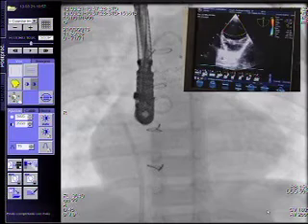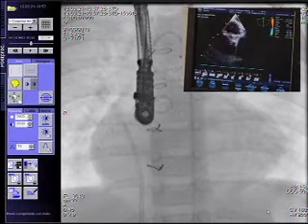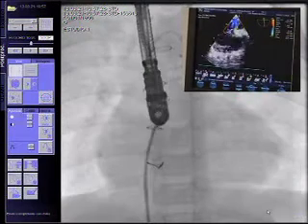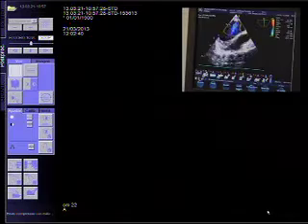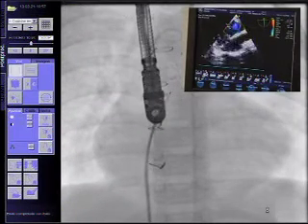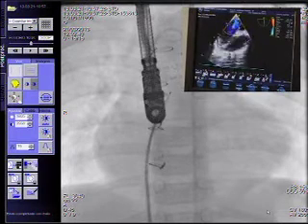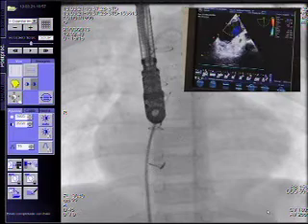Enséñame el eco. Looking at the echo. I am trying an orthogonal view. I am trying to not lose this place. Yes. Right now, can we move to another echo plane? Can we check it in more planes? Maybe the 4-chamber view, Manolo.